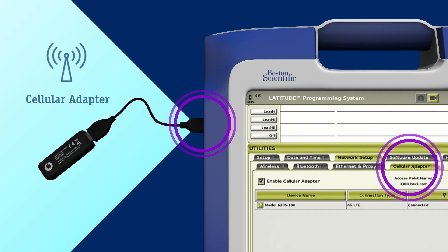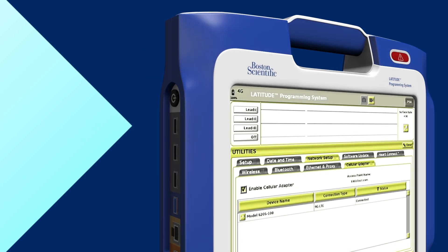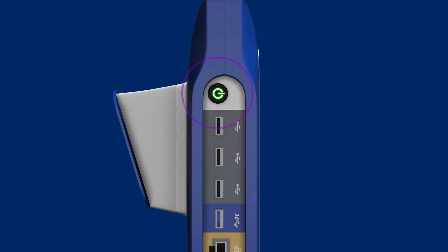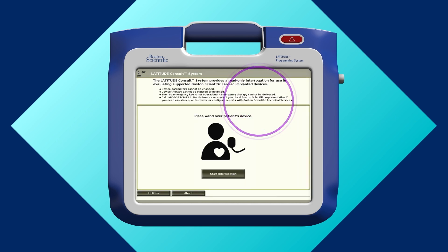If you're using a cellular adapter, attach it before you power on the system. Next, power on the system. If you see the select mode screen, press the start read only mode button to access the Latitude Consult application.